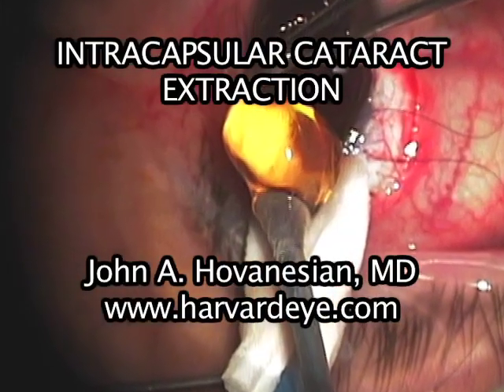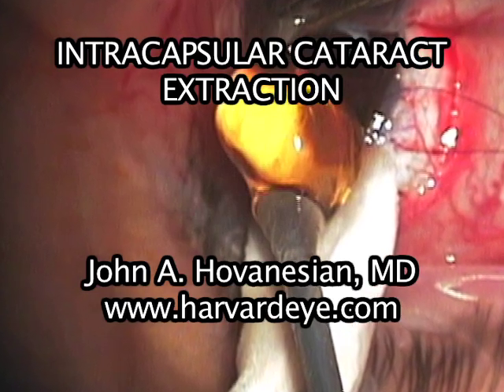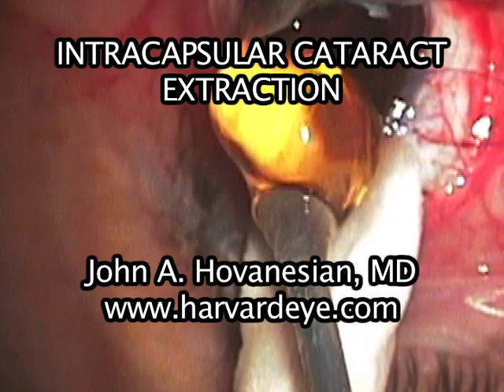I'm Dr. John Hovenessian. In this video, we'll talk about intracapsular cataract extraction, a useful technique for cataract surgery when the zonular support for the lens is either weak or absent.